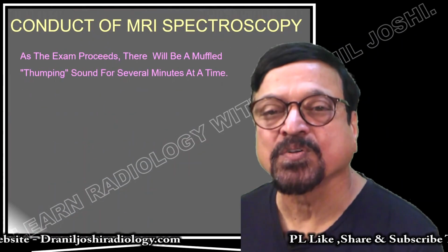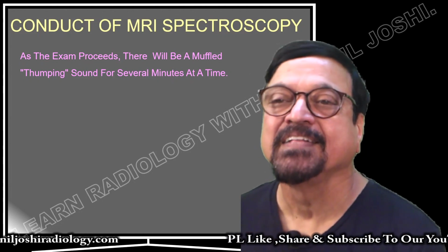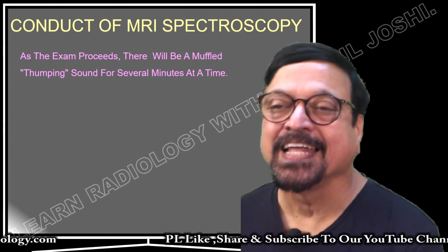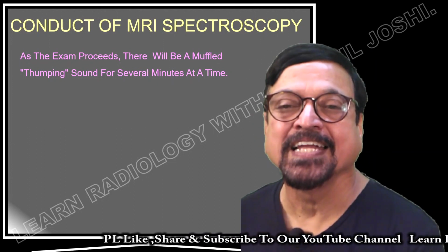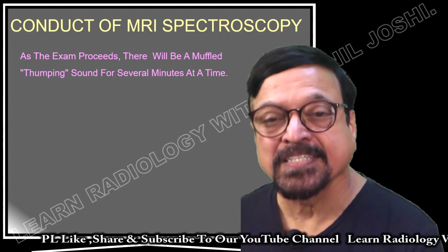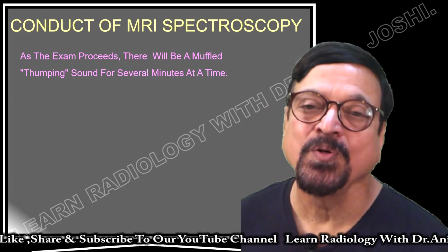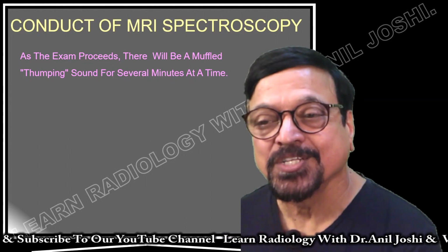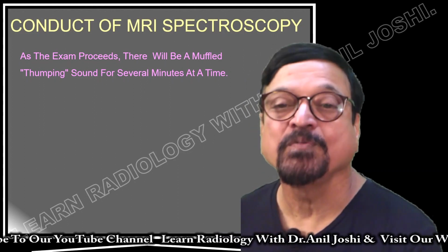That is the same as what we are talking about, doing an MRI scan to start with. Now the patient will have to hear multiple sounds, then multiple vibrations. Sometimes patients use earbuds so that the sound will be less, but all these things are below the tolerance limit. You will not have any trouble with it, but you will have to get used to it in the first few minutes. We have made a video in which we have shown how the MRI sound comes and how to protect against it, how to overcome the fear of claustrophobia.